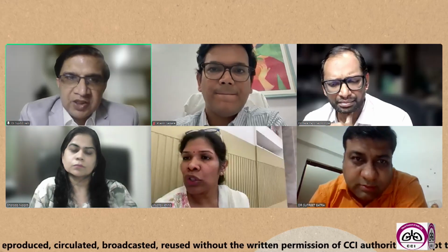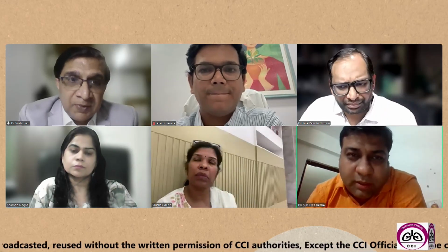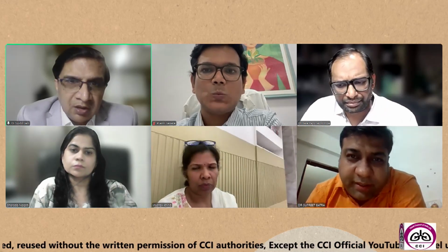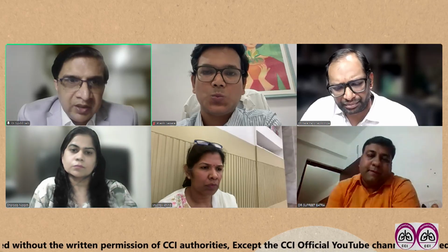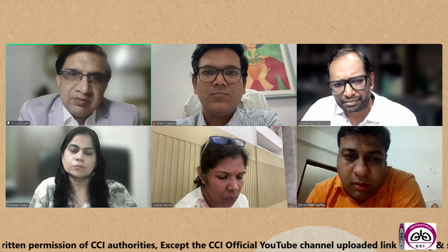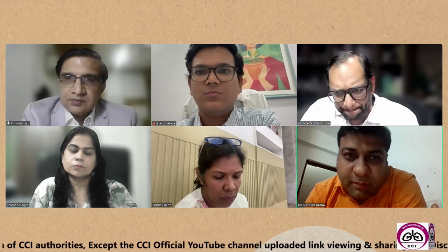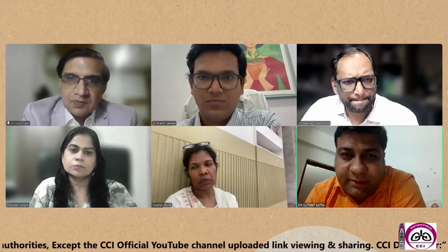So if you are suspecting sarcoid, endobronchial, transbronchial, and TBNA, I would always send for GeneXpert and culture, because a lot of times there is a confusion between sarcoid and TB. There's always a problem there. So if GeneXpert comes positive, it helps you a lot. Even if the parenchyma is normal, we must combine with TBLB and EBLB.